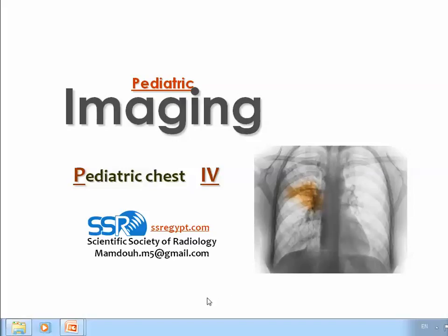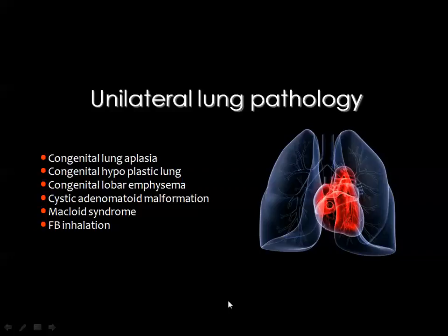Now we will have the final part in the imaging of the lung, which is the unilateral lung pathology.